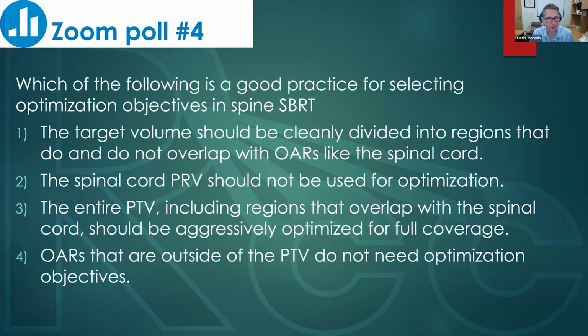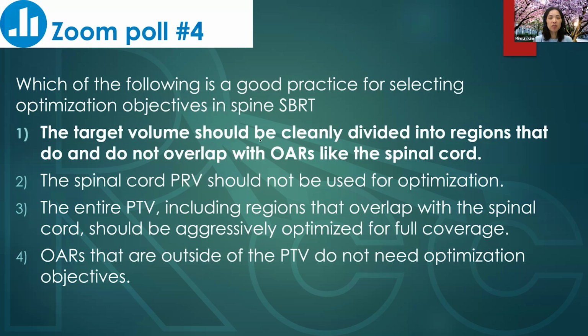What about you, Minsun? Are you doing 4D CT for spine SBRT? No, we don't think that breathing is actually important in the spine location, so we don't do 4D CT either. It's a good question. It's something we wondered ourselves when we first started, and we ultimately investigated it and decided not to do it. And we don't use any diaphragm control device or anything like that either.